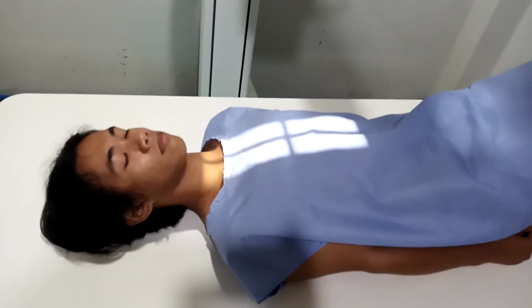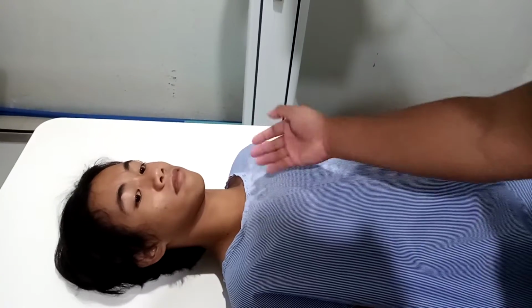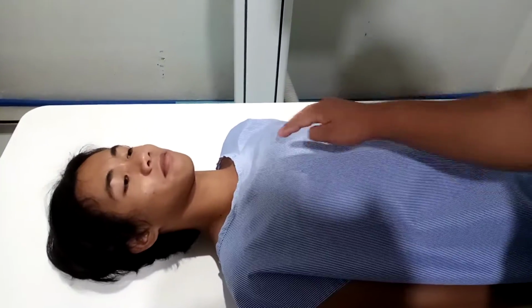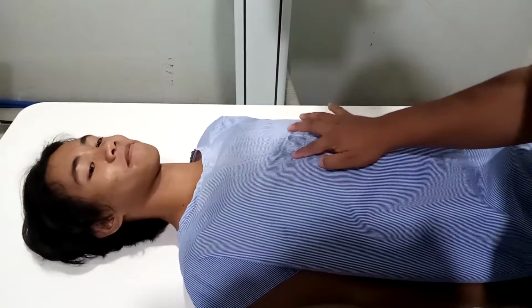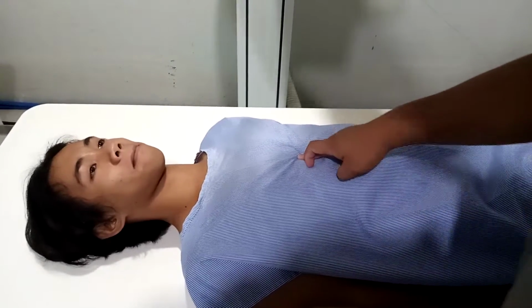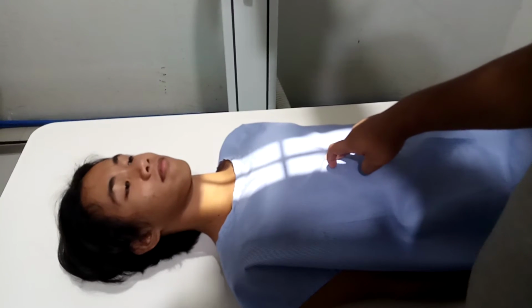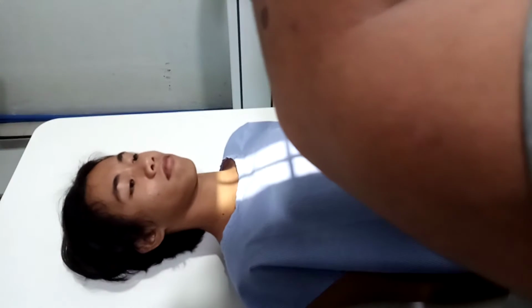Then, midway of the jugular notch, the patient's sir, I'm going to touch, okay? Okay, great. This is the patient's jugular notch, and the xiphoid process is here. I'm going to touch, sir, okay? Great. So, midway. So the central ray must be at midway. Collimate.